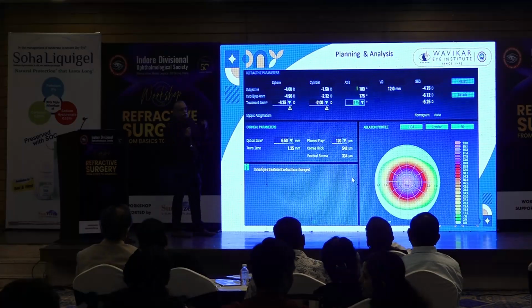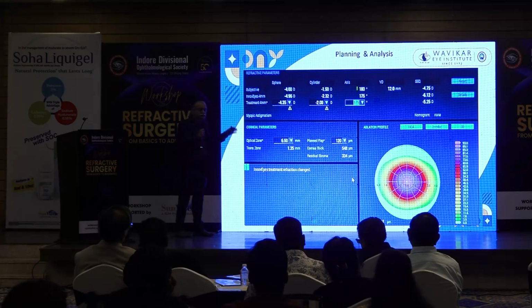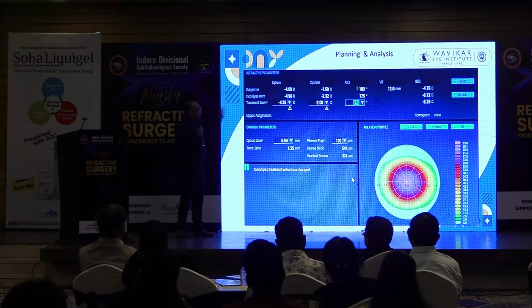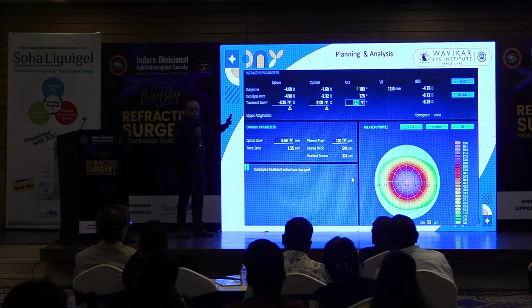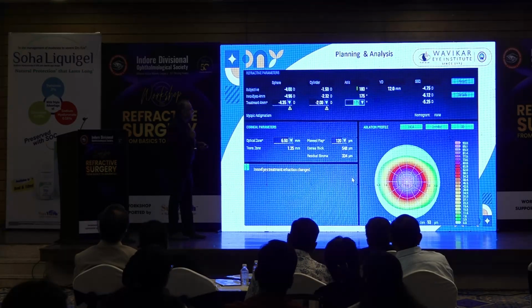And I was talking with respect to 10% only. I was not talking with respect to that. But what is a good thing about this is that if the cylinder matches, we can blindly touch this cylinder, we can treat it as it is, whatever algorithm is there, and it works just very well. Patients are left with very minimal cylinder or no cylinder at all.